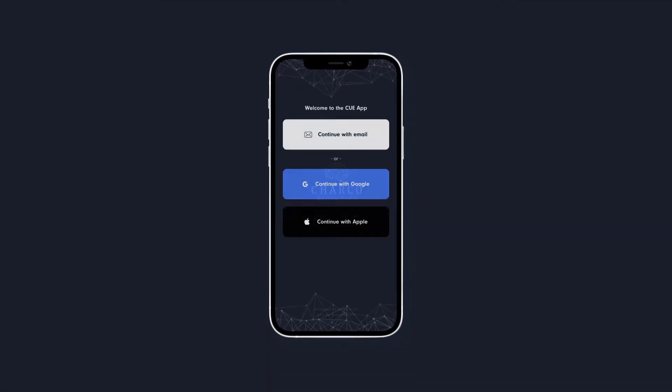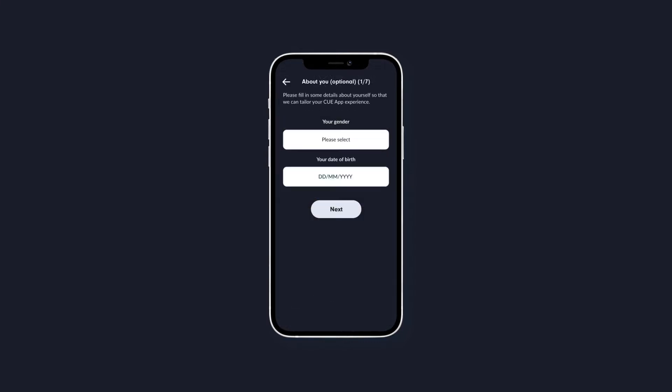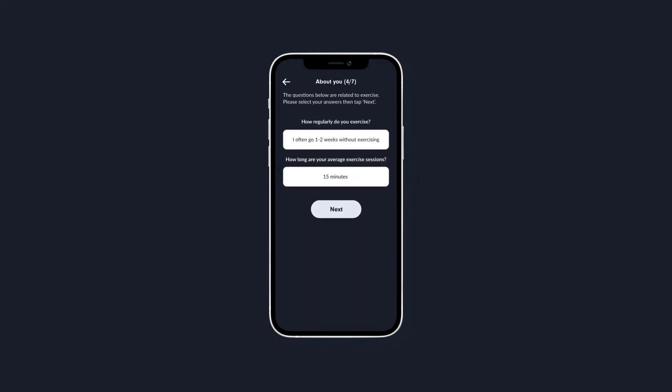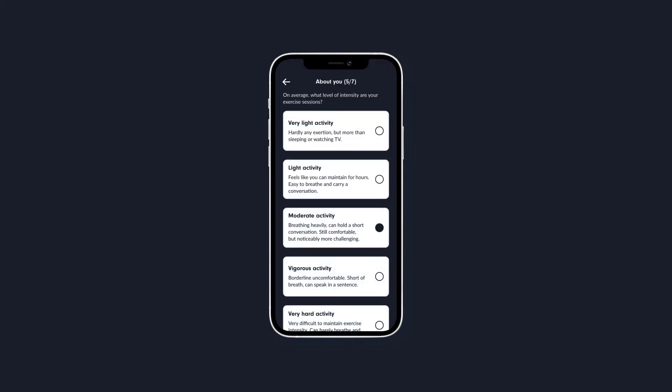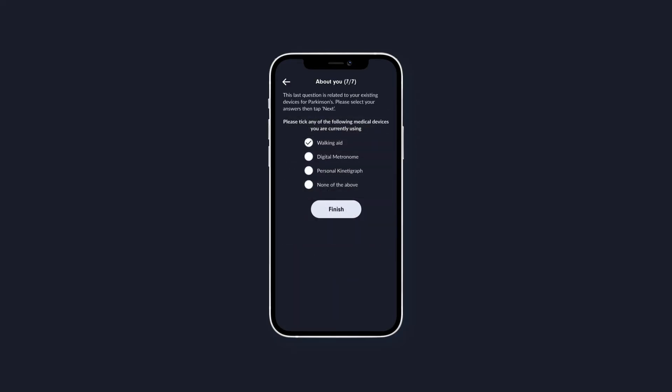When you first open the app, you'll be asked to create a profile using your email, Google or Apple account. This is to gather some initial info on your symptoms, exercise and diet, and will help track any data you choose to enter into the app to show your healthcare team or just for your own interest.